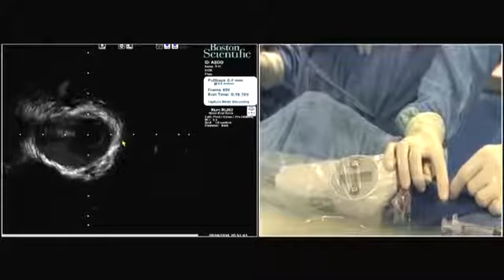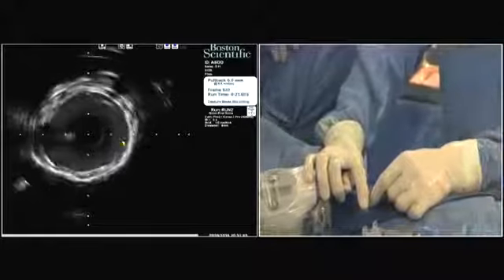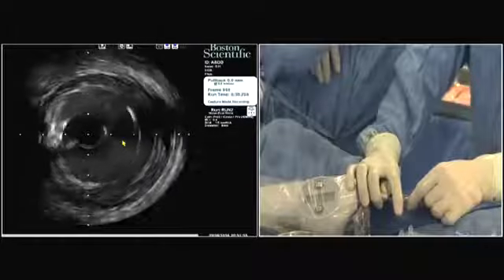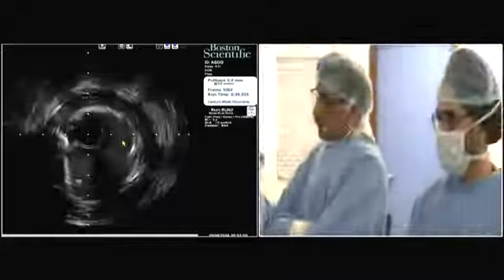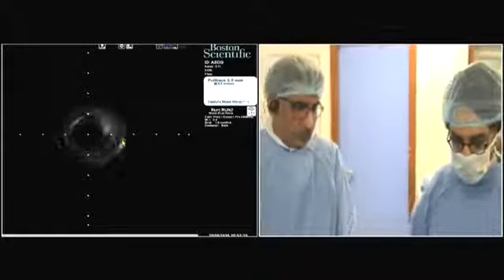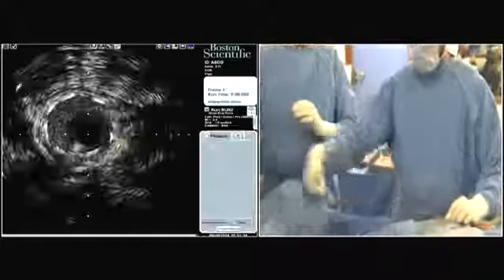So this is now pulled back in the LAD, yeah? Yes. Look at the proximal part of the stent. So that looks good. I would take a pull back from the diagonal now. Yeah, that did look nice. Only a very, very small amount of malapposition in the ectatic segment of the LAD. Yes, right. Any comments from the panelists about this?